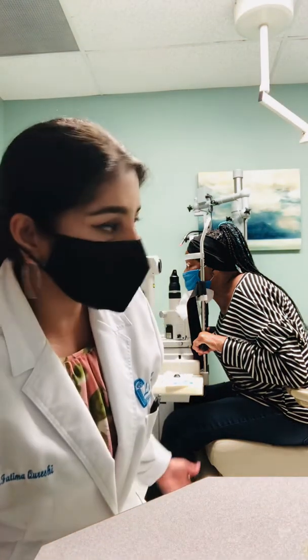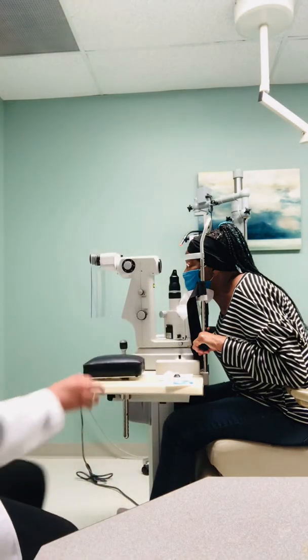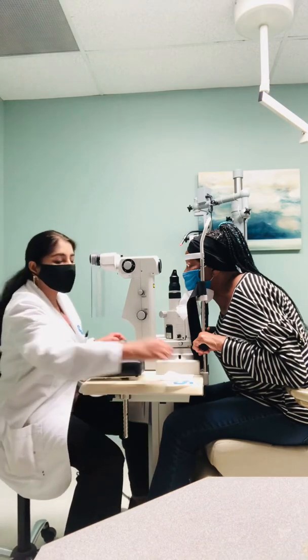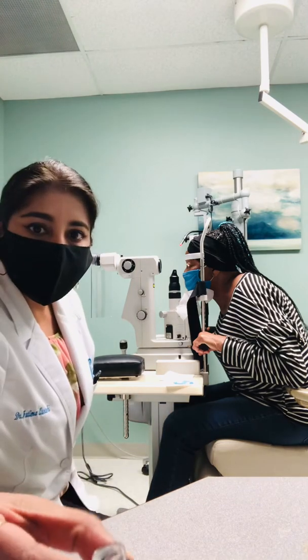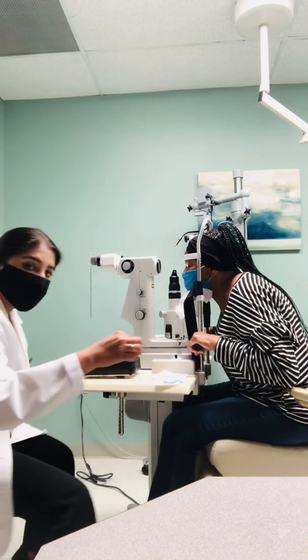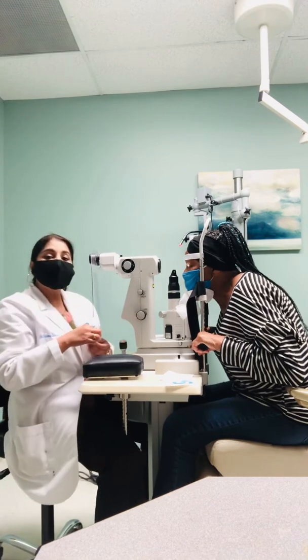This is a painless procedure, and you're going to watch that. The patient is numb and aligned in position. This is a little lens that we use, and that is going to go on her cornea. Through this lens, I'm going to make that opening in her iris, which is the color part of the eye.